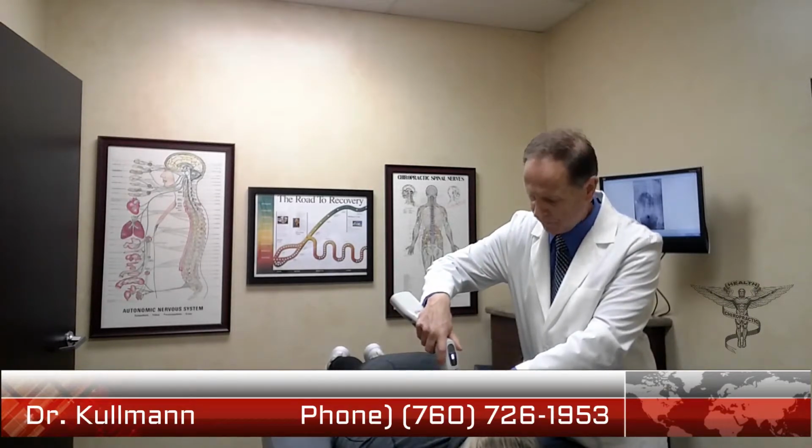Now we know Tori's got a few mid-back problems, and so now we're up in her mid-back and there is a change in the leg lengths. That's an indicator for us that neurologically at her 8th thoracic vertebra, that's not functioning very well. Put both hands back to your side. So we're going to go ahead and adjust the 8th thoracic vertebra. A little sore in there, Tori? Yeah. Put both hands above your head for me. Great. You balanced out nicely. Put both hands back to your side.